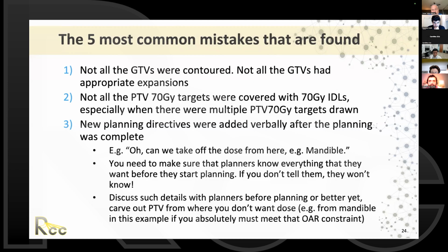Something else that has been found is that new planning directives were added verbally after the planning was complete. For example, someone can say, oh, can we take the dose off from here, move it here, for example, the mandible. You need to make sure that planners know everything before starting the planning. Of course, there is always a discussion and things can be changed. That's totally allowed.